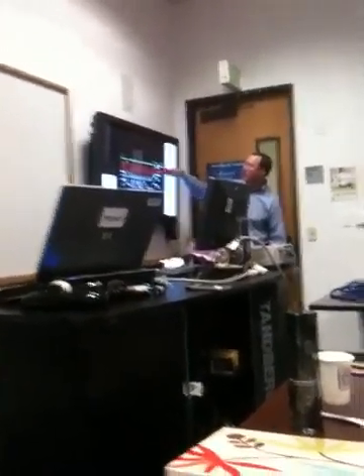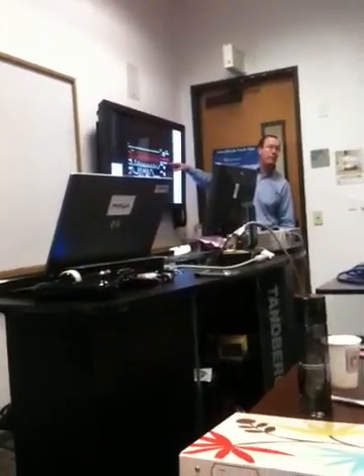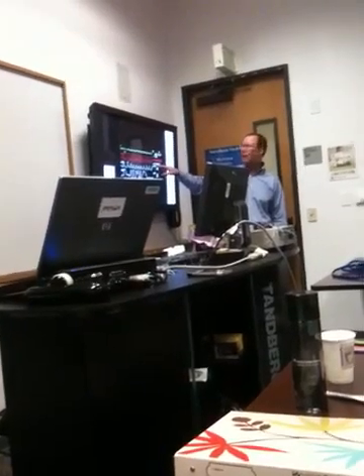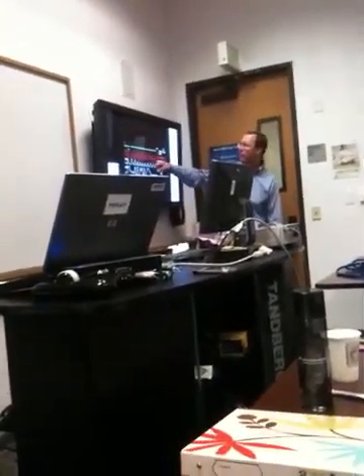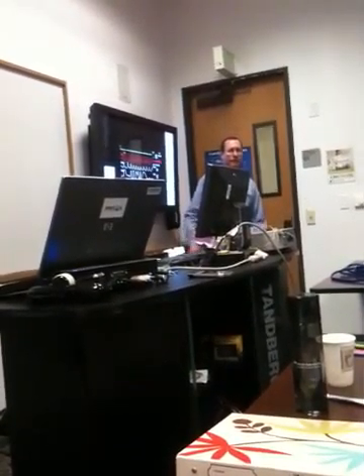So they got ABP, that's the direct one, and then you've got an NBP, so that's the non-invasive. So the non-invasive, you're always going to get just a digital readout. And you know, there's a little bit of difference between the two. So here's your arterial waveform, and then this one that says pleth, do you know what that is?